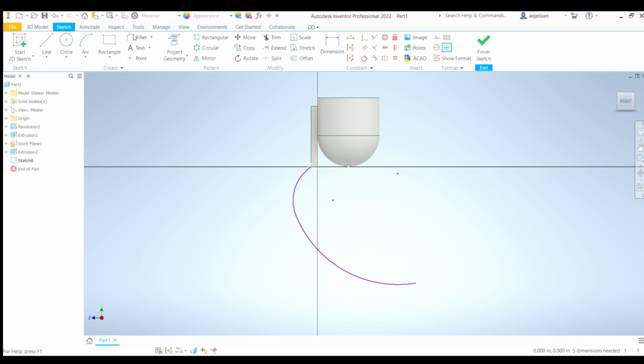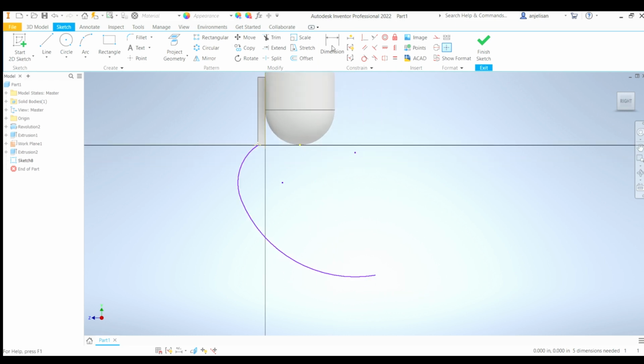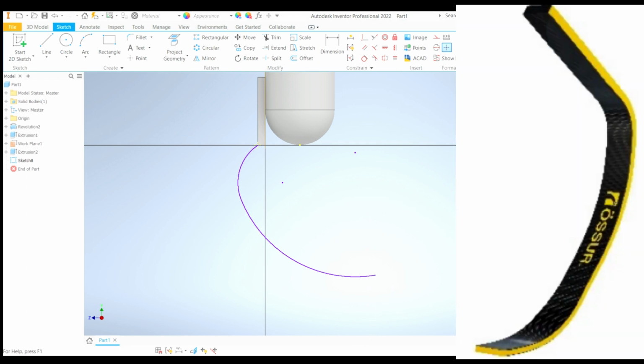Okay, so now we have our little arc here. Now let's try to define the height from this to this. If you remember, we know the height from the bottom of the amputation to the ground to be 8 inches, right? So we're just assuming here that this is the bottom of the amputation, though that's not exactly accurate, it's just an assumption. And then this would be the lowest point of the cheetah blade, and it's the case here. You'll see it's just flattened at this point.